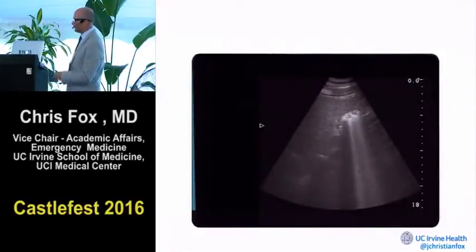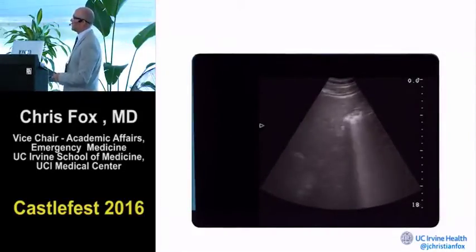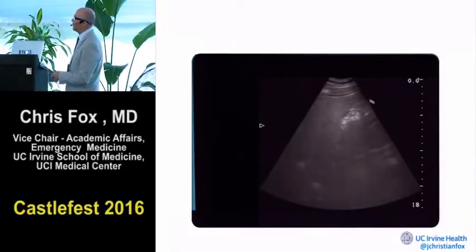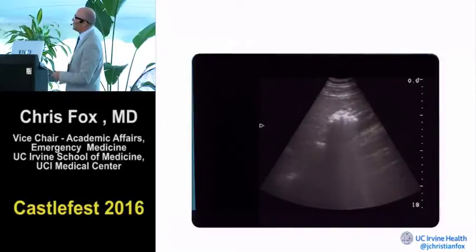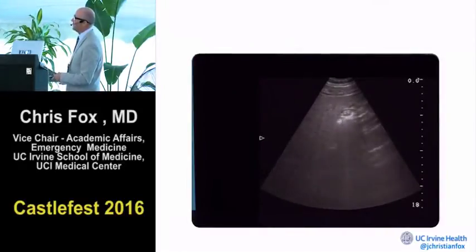But like at this one here, this is from our old ultrasound machine. This is probably circa 2002, a BK Hawk ultrasound machine. We actually still have it. It still works. We don't really use it though. But you can see they're saying, is this a WES? Is this a WES? What do you guys think? Is that a WES sign?